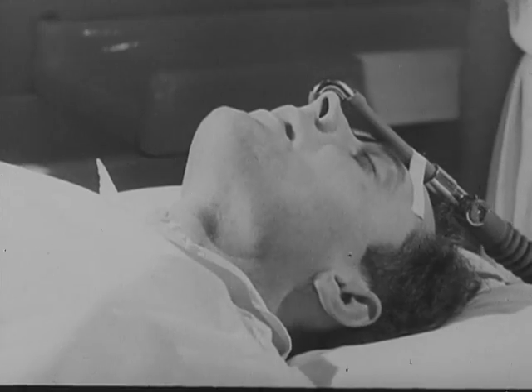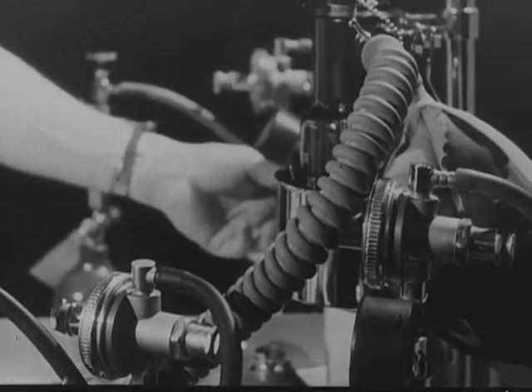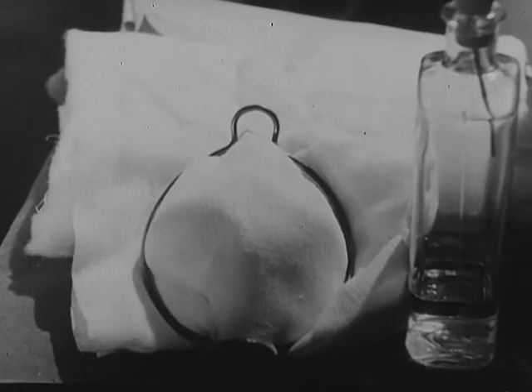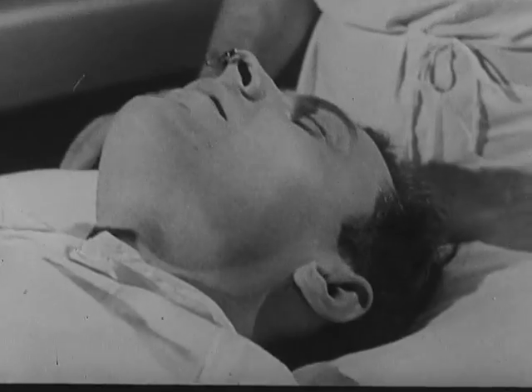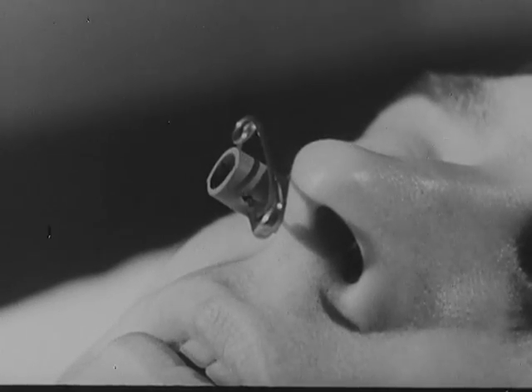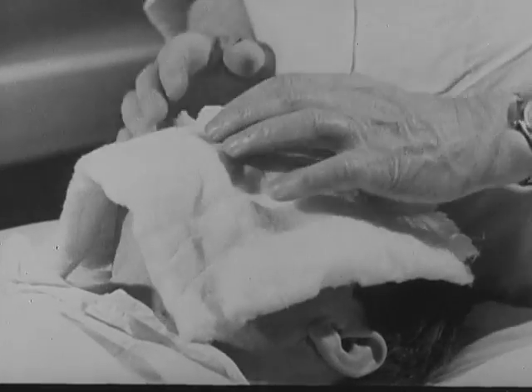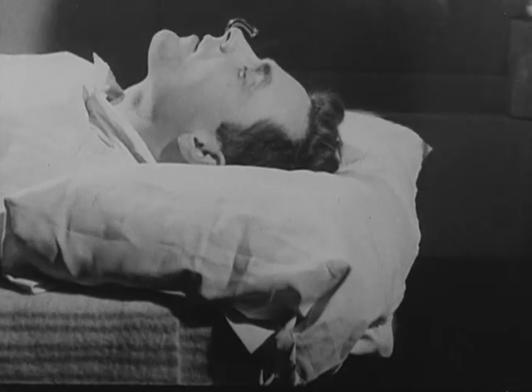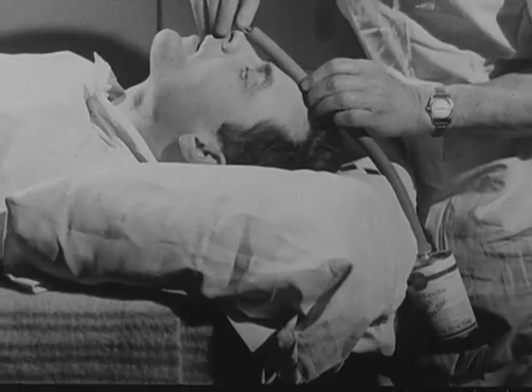Anesthesia can be maintained as before by using an anesthetic machine, or by means of an ordinary mask and ether drop bottle when the anesthetist has free access to the patient's face. In this case, the metal connection may be discarded and the endotracheal tube is transfixed by a safety pin to prevent its disappearing down the nose. A further alternative is Flagg's method, used in the same way as with oral intubation.